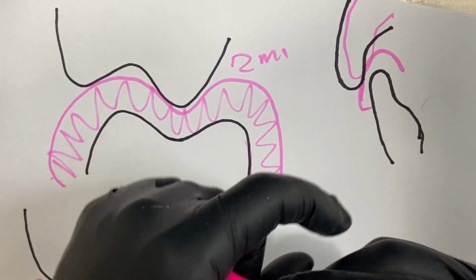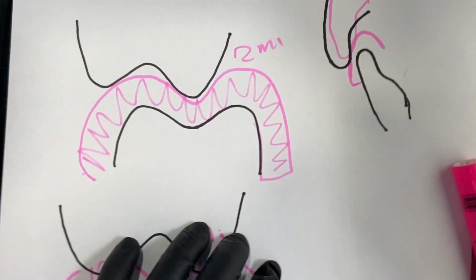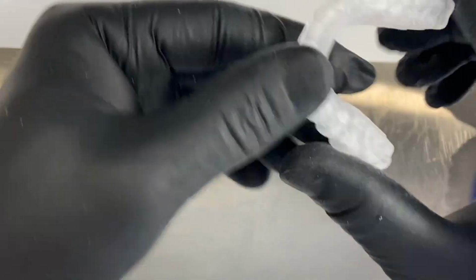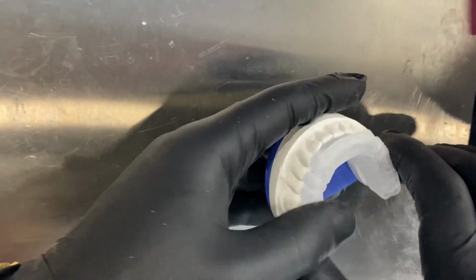So in order to try to gain a little more space, we started working with products made of nylon. And the nylon offers a little more flexibility. It's a material that technically can squeeze. So this is a material, and I'm going to make some demonstrations so you can see how strong the materials can be.